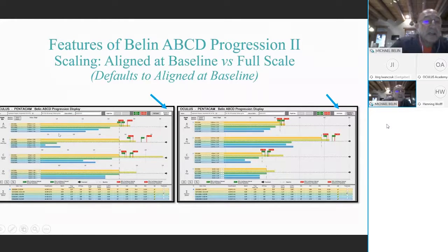So if you look here, and again, this may be hard to see on the screen, it says 1.0 here and 1.5 here, but if we go back to the B parameter, it's 2.5 and 3.0, and here it's a different number. So each parameter is graphically displayed to give you the maximal separation. In other words, to make it easiest to see whether there's been change or not.